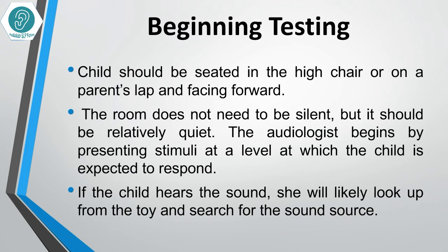At the beginning of testing, the child should be seated in the high chair or on a parent's lap and facing forward. The room does not need to be silent but should be relatively quiet.